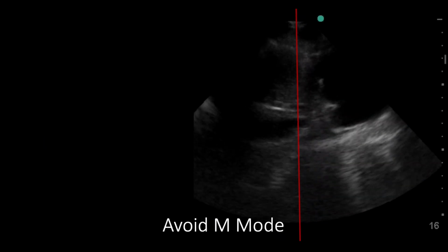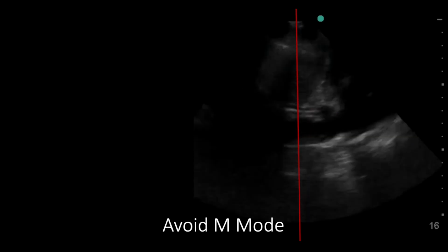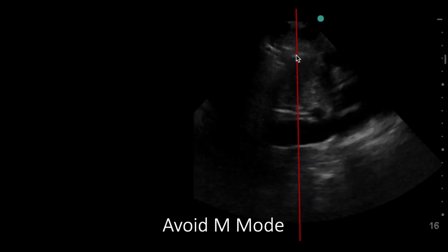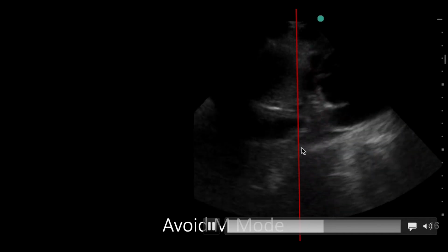One note here is M mode, and I'm going to encourage you to avoid M mode. The cardiology techs and cardiologists use M mode to calculate IVC, and what that means is they drop a line down the middle of the screen and they measure what happens over this line. It makes calculations very easy for our cardiology colleagues.